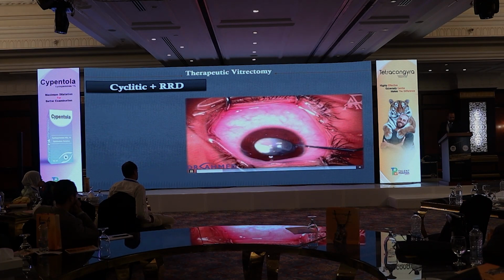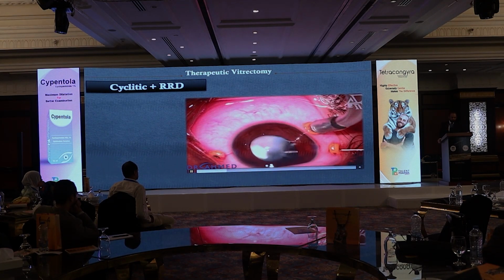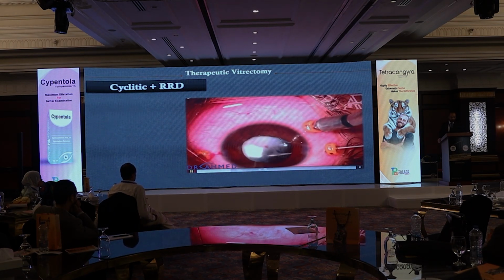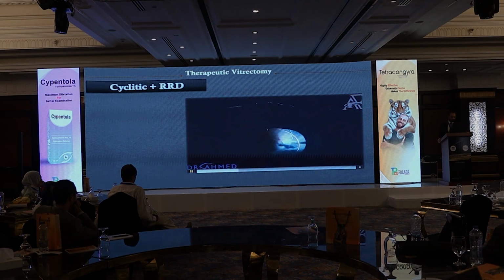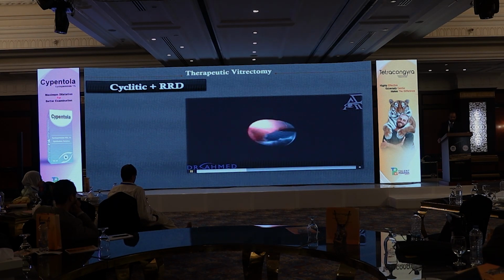We implanted the 3-piece IOL. The membrane was very tough, so we tried to use the ocutome first, but it didn't eat it, so we tried to make a plane with a 27 gauge needle, and after successfully making the plane, we got into it and tried to dissect it. As you can see, it's really tough, and the ocutome is having a hard time trying to eat through it.